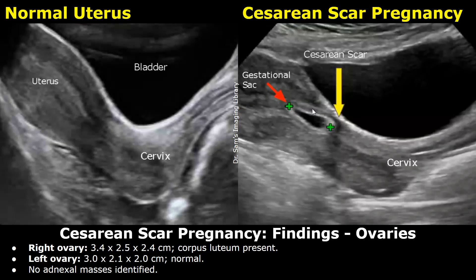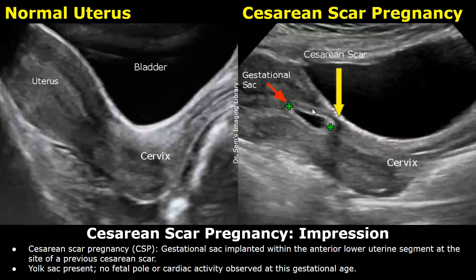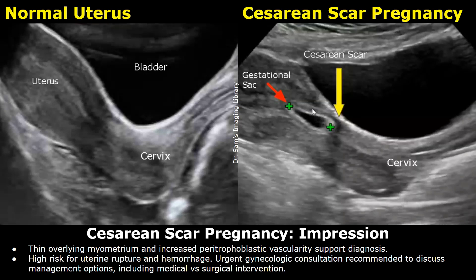The ovaries are normal. Impression: cesarean scar pregnancy. Gestational sac implanted within the anterior lower uterine segment at the site of a previous cesarean scar. Yolk sac present. No fetal pole or cardiac activity observed at this gestational age. Thin overlying myometrium and increased paratrophoblastic vascularity support the diagnosis. High risk for uterine rupture and hemorrhage. Urgent gynecologic consultation recommended to discuss management options, including medical versus surgical intervention. Thank you so much for watching. Stay tuned for more imaging videos.